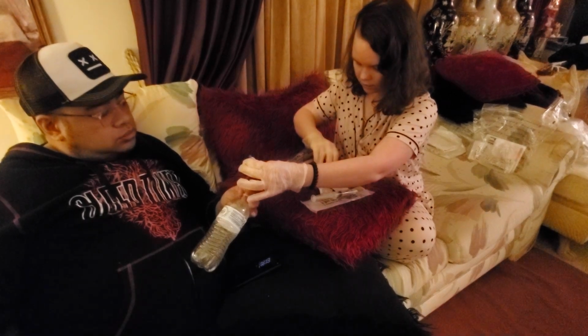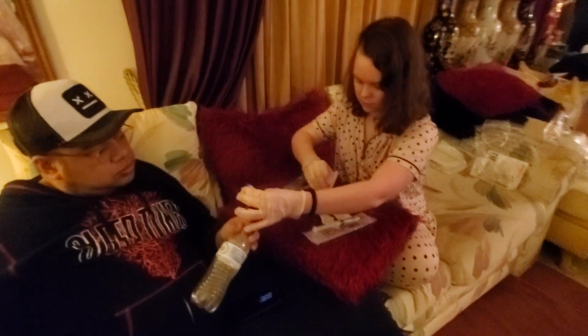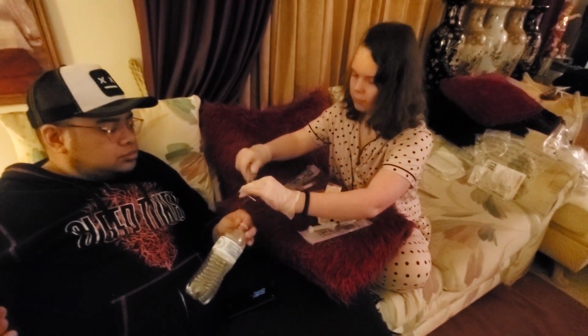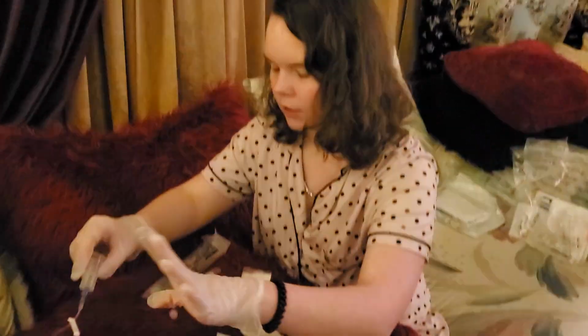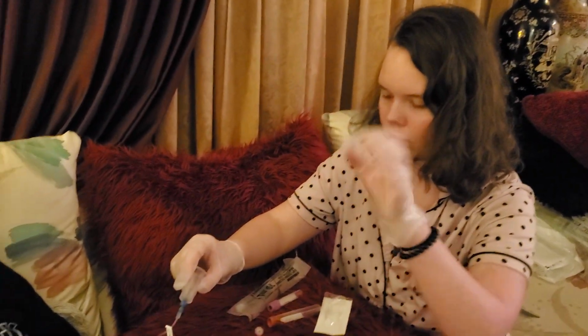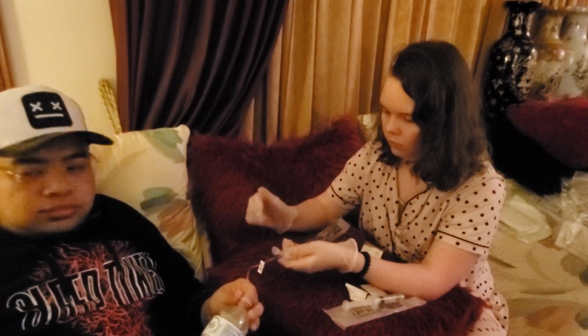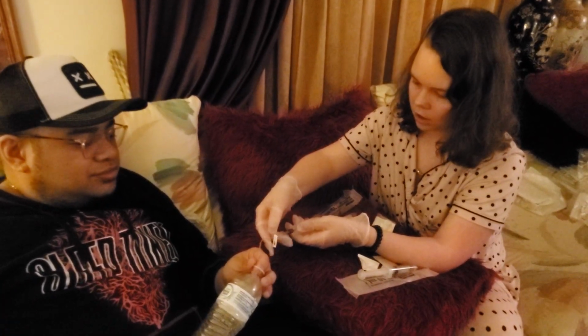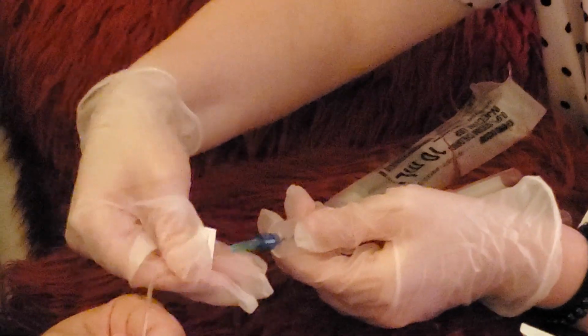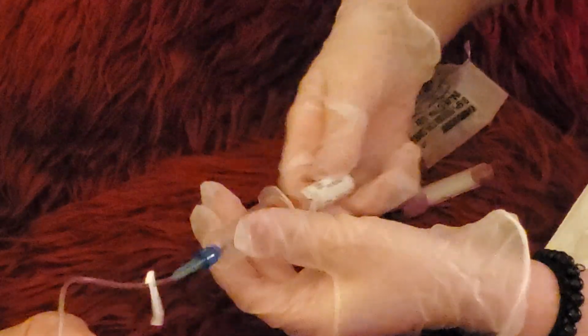Now, I'm going to take my central venous access device, CVAD. I mean, not just the central venous access device is what I'm drawing blood from. This is just a venous access device or a vacutainer. So I'm going to plug that up. I can go ahead and unlock this because the vacutainer is going to keep it from leaking. I'm going to push. Pretend I push this through and I get blood.